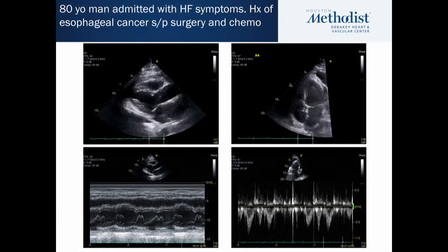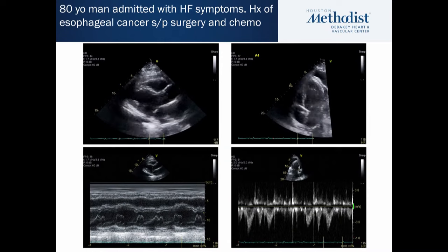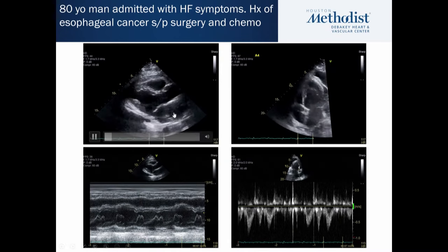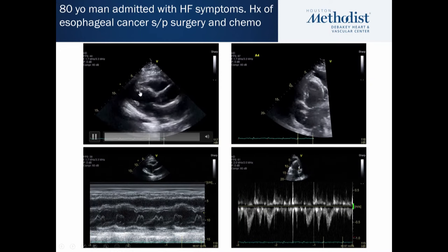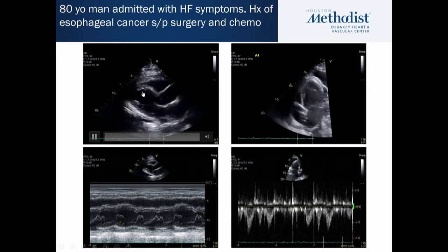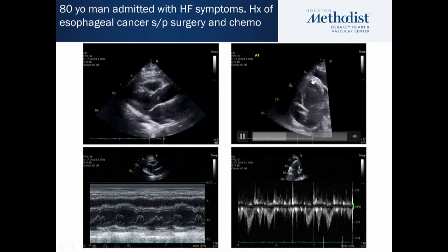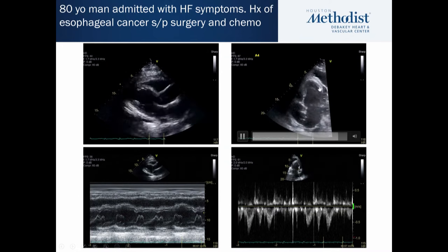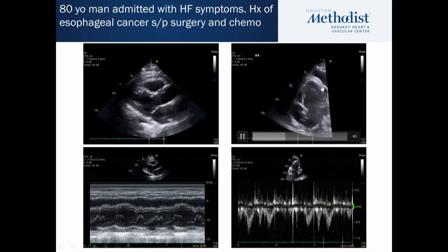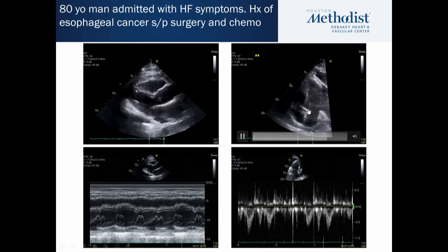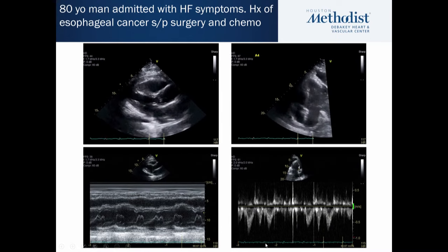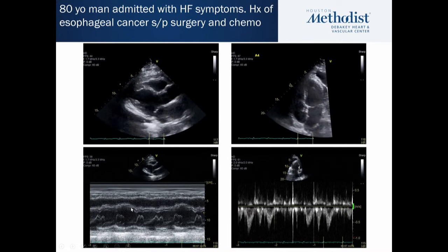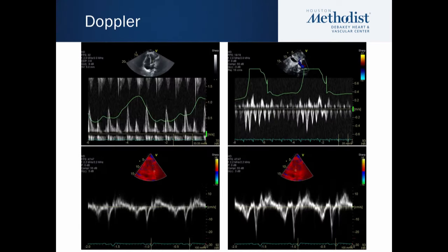Here is an important case — an 80-year-old man with heart failure symptoms, prior esophageal cancer surgery and chemotherapy. The first image you notice on echo is the abnormal septal motion occurring not with every beat but rather with every few beats, where the RV takes over the space of the LV. Notice this space where the pericardium doesn't slide as you'd normally see. Also notice the variation in LV outflow despite sinus rhythm. On M-mode you can demonstrate how the septal shift is occurring not with every heartbeat but with respiration — this is obviously constrictive pericarditis.